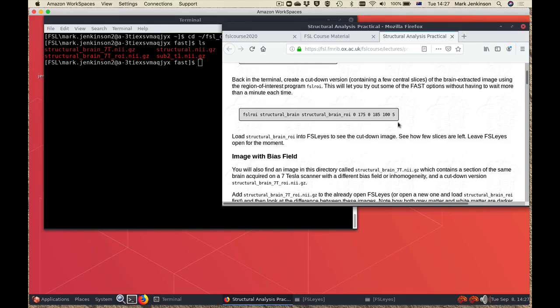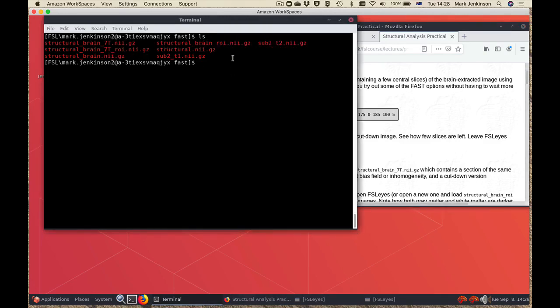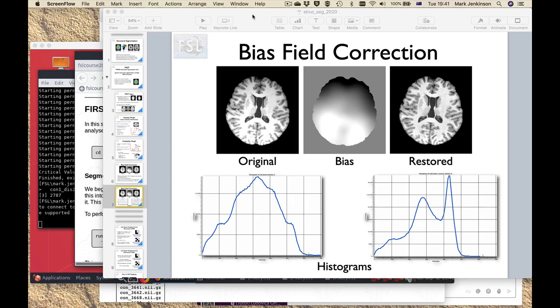The way that you run FAST doesn't change at all — it's the same whether you run it on a small number of slices or on an entire image. Once you've done that you'll end up with a set of images: the structural, the structural brain, and the structural brain ROI. There are also 7T versions — structural brain 7T and 7T ROI — which are images taken on the 7T scanner of the same individual. This part of the practical relates to the lecture section on bias field correction, where we take an original image with bias field, estimate the bias field, and produce a restored image.